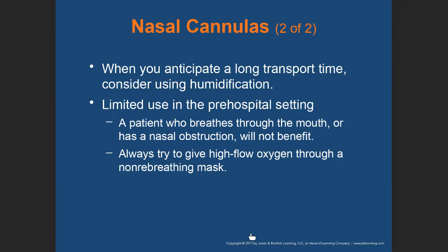Now, if you're going to keep a humidifier on the unit, which is commonly done in Jamaica, it needs to be kept clean, right? If the port is open to the atmosphere, microorganisms can get into the canister. So if you leave it on the cylinder and it's not clean, and you give a patient oxygen with that humidifier, you're introducing microorganisms into the patient's lungs, and then we start to wonder how the patient got pneumonia when they might be trying to recover in the hospital. So it needs to be clean.